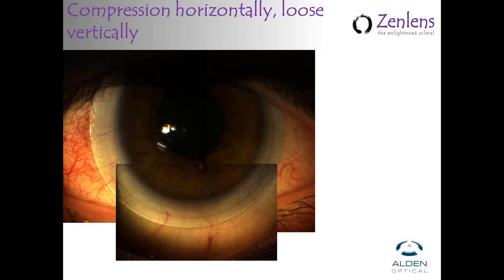So this is an example of an eye, I think one of Dr. Jedlicka's patients, where you can see a little bit of impingement and some blanching of the vessels. Some of the vessels are allowing the blood to pass through, but you can see it's being cut off a little bit on this side. It's a little bit whiter over here.